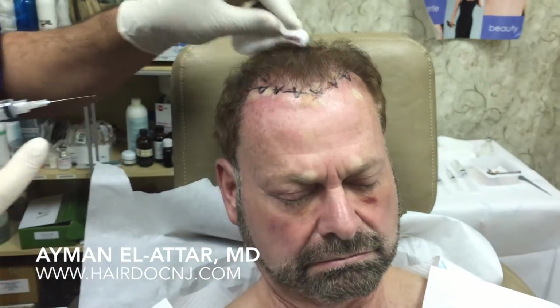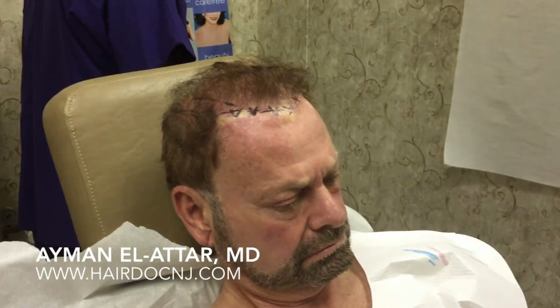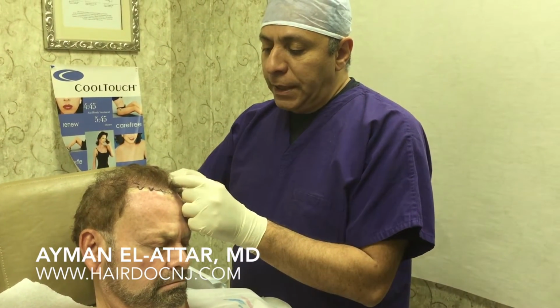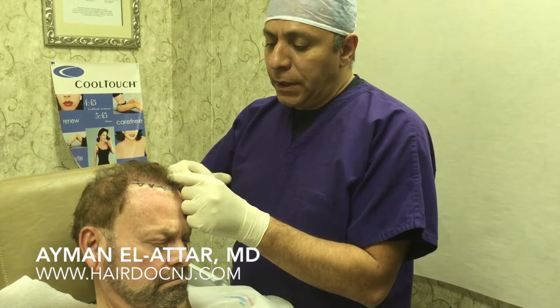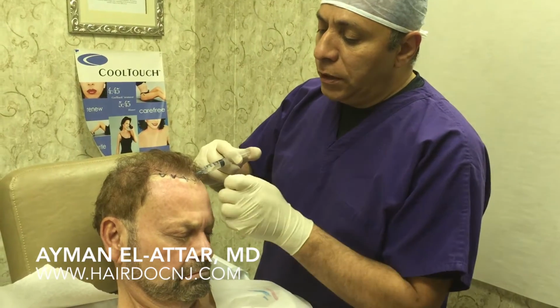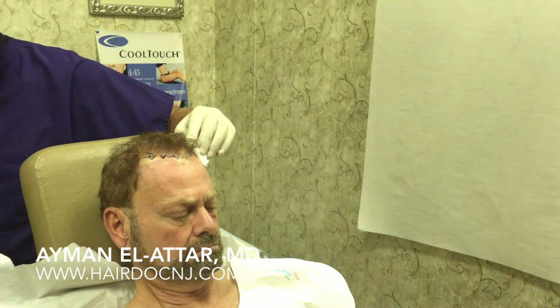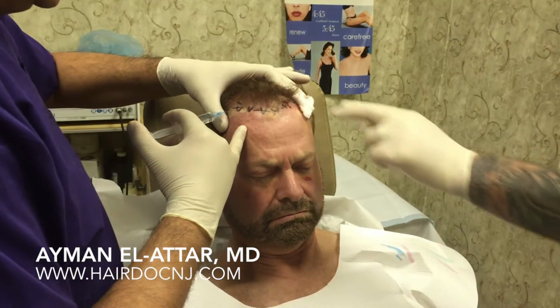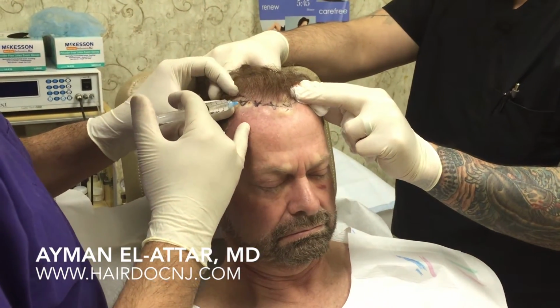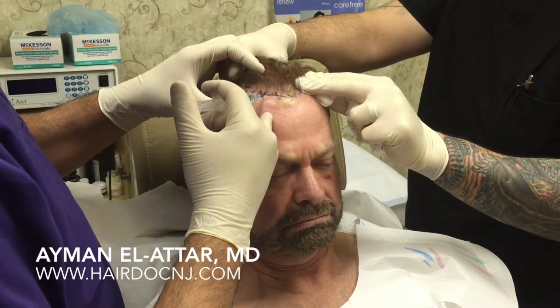Now that we numbed the frontal hairline, the second step is to use mild tumescence. Okay. So I like as well to reinforce my anesthetic using some Marcaine because Marcaine gives the long-lasting analgesic effect for patients in the post-operative period. So you don't need a lot of analgesics or a lot of codeine to be used in the post-operative period. It gives very good pain control. And again, we use the entry points from an area that's already anesthetized, as you see.